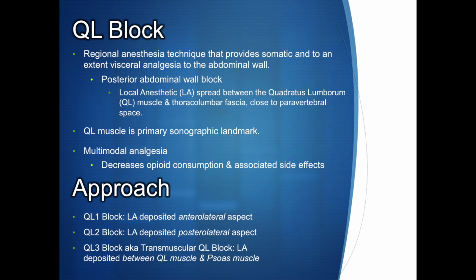The QL3 block, also known as the transmuscular QL block, has a site of injection through the QL muscle to the bordering side of the psoas muscle.